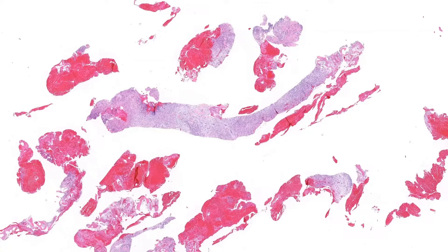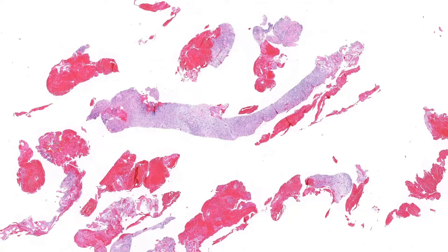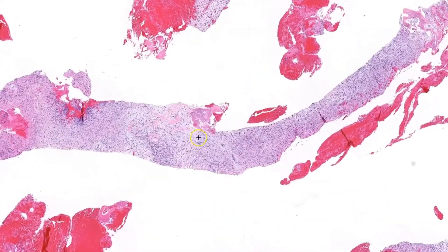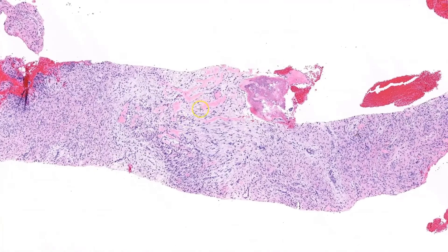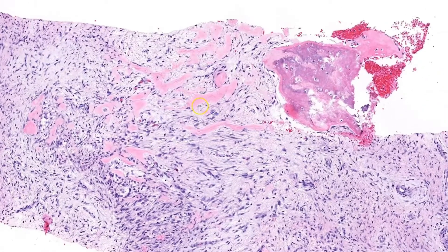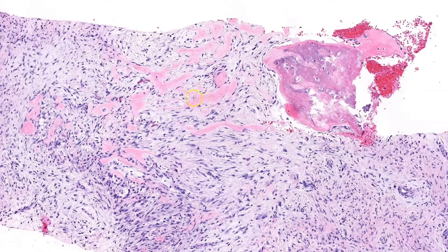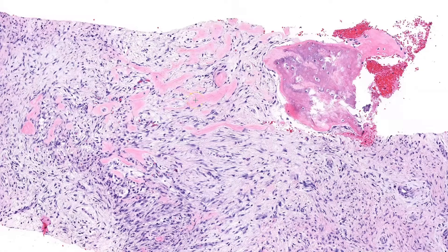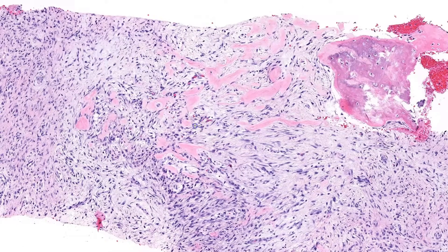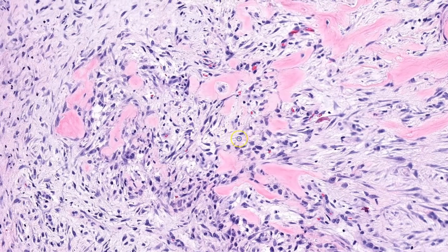This is a core biopsy of a rapidly growing soft tissue mass near the clavicle in a 23-year-old female. At low power, the first thing I notice is reactive bone formation. You can distinguish this from mature bone by the lack of lamellae or lines, as well as the haphazard arrangement and lack of well-formed bony trabeculae. Surrounding that reactive bone is a variably cellular proliferation of stellate to spindle cells.